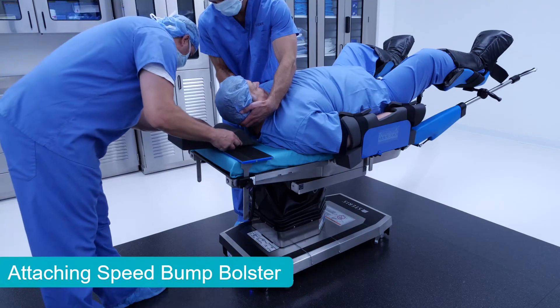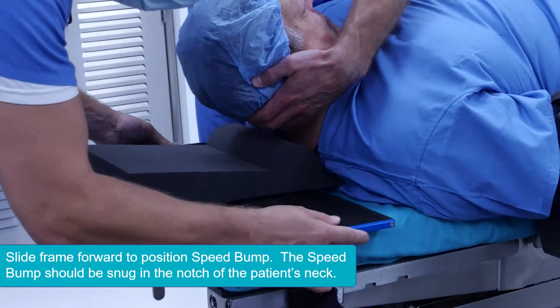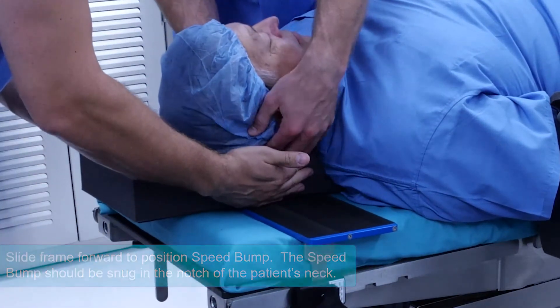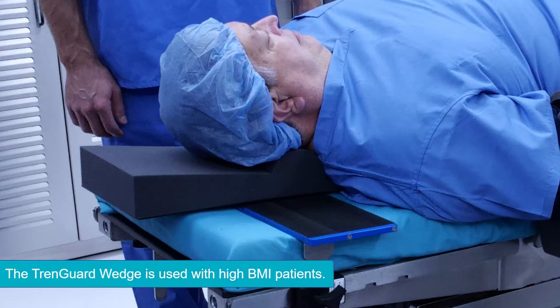Attach the speed bump bolster to the Velcro on the frame by sliding it into place at the cervical notch of the patient's neck. There are different varieties of the speed bump bolsters offered with TrendGuard to meet the needs of the patient's size and body morphology. Here, we have attached a bolster suited for high BMI patients.